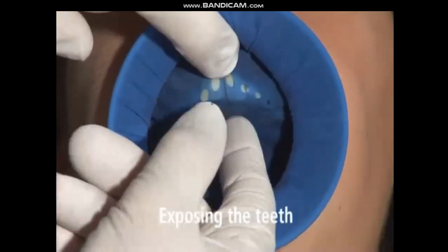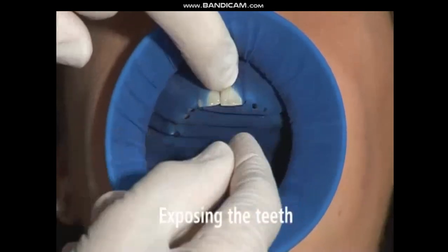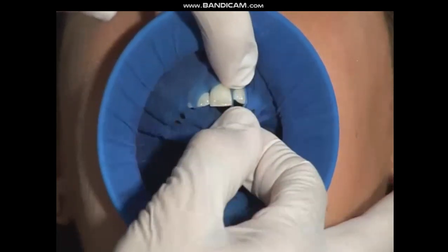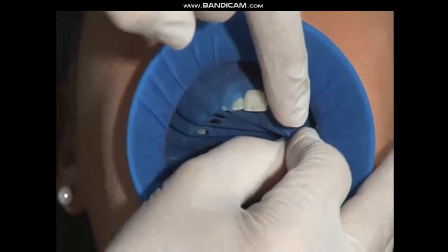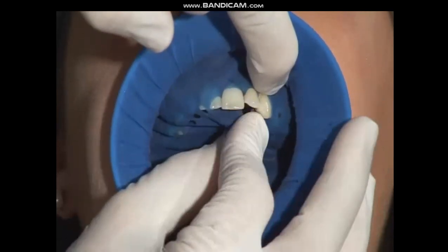To isolate the individual teeth, slip the interdental septum of the OptraDam through the contact points between the teeth, initially without the aid of dental floss. This is much easier than trying to put the holes over the individual teeth. To simplify the process, slightly pull the septum with the index finger of one hand in the direction of the fold and hold it on cervical level.